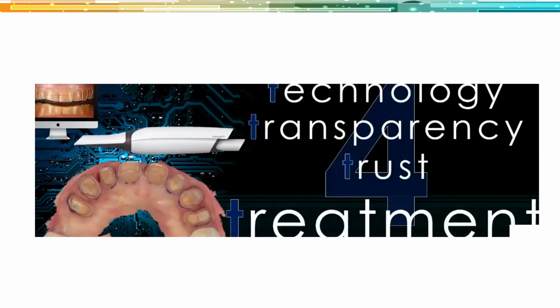And so I came up with this concept called the 4 T's. And what do the 4 T's stand for? The first T is technology. We use the technology to provide transparency. And so we will send our scan feed from the scanning laptop onto the large monitor that's in our operatory. And we really provide transparency for patients.